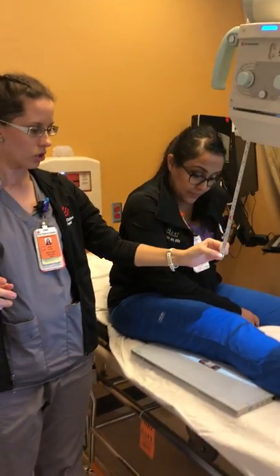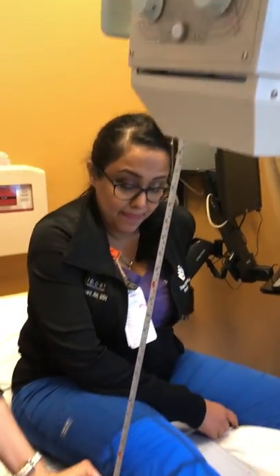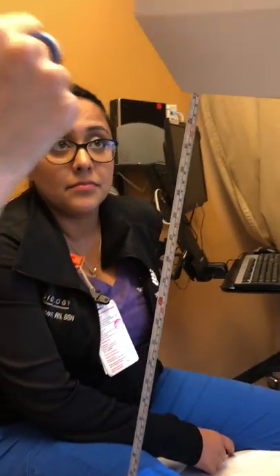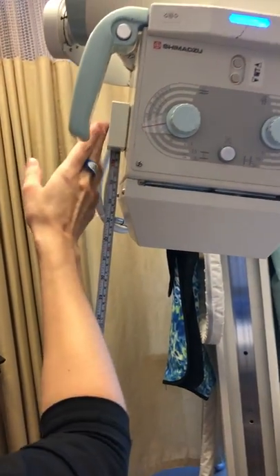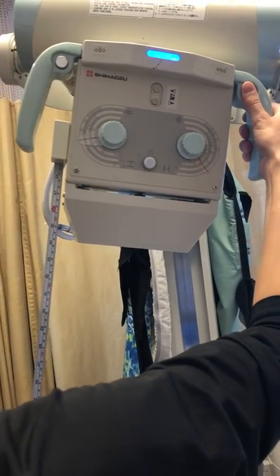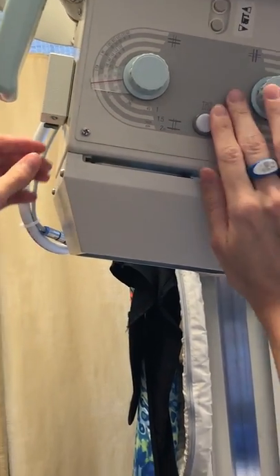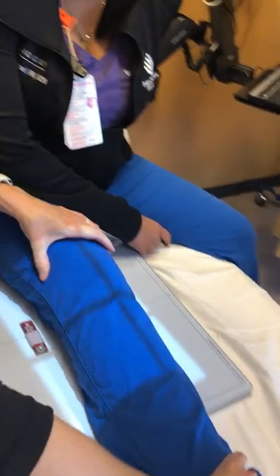Your source-to-image distance from your x-ray tube to your detector should be 40 inches. I'm currently at almost 38, so bring down your tape measure — located on the side of your portable — and adjust it up to 40 inches. And that is positioning for an AP knee.